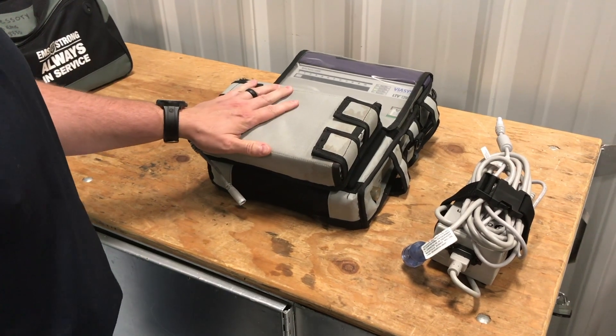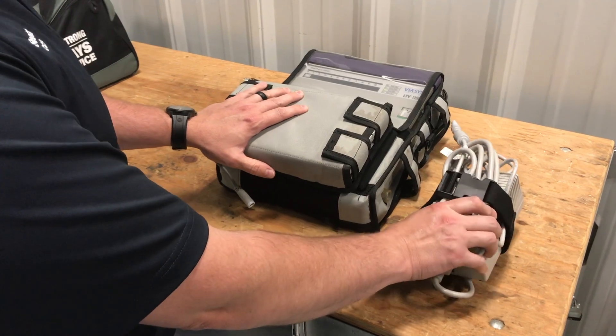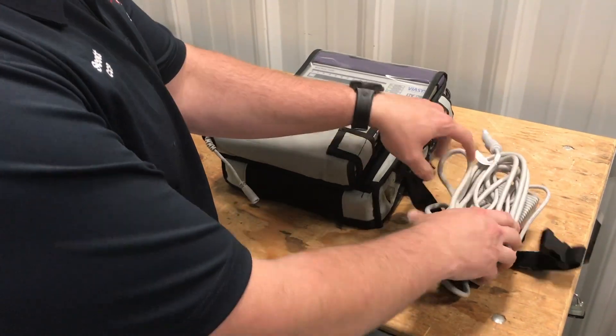That's all there is to it for the vent check. Now we're going to go over how to charge the LTV 1200 vent. We've got our AC power pack — we got that out of the accessory bag — so we'll go ahead and open that up.